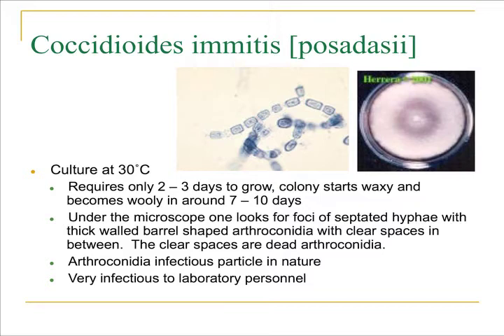What occurs is as the colony ages, these barreled arthroconidia can break off from the hyphal strand, and they become the infectious particle in nature. This organism can be very infectious to laboratory personnel, so you have to use extreme caution when you're looking at any of these mold colonies.